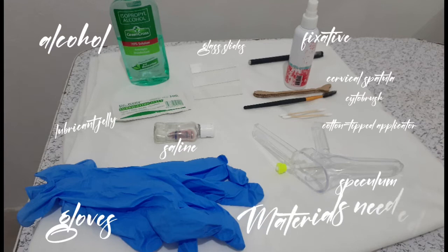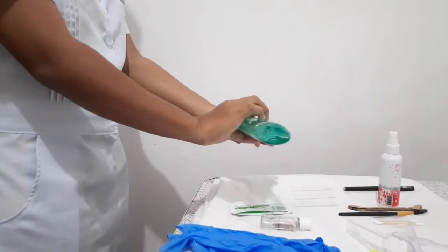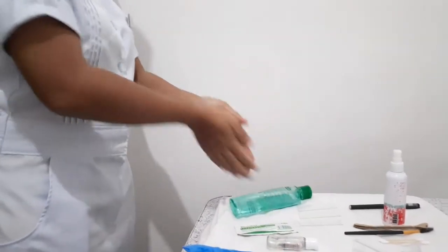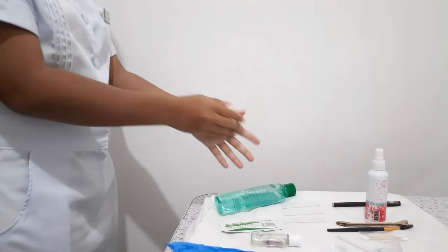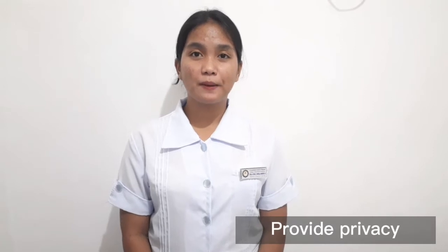For today's return demonstration, I will be doing the pap smear test. Before the procedure, make sure to check the doctor's order, perform hand hygiene or hand washing, then provide privacy and comfort to the patient.